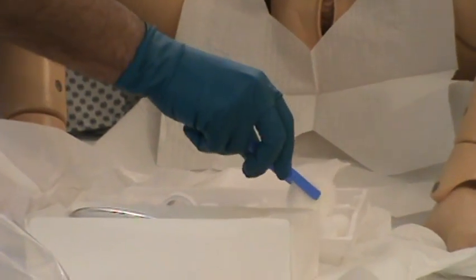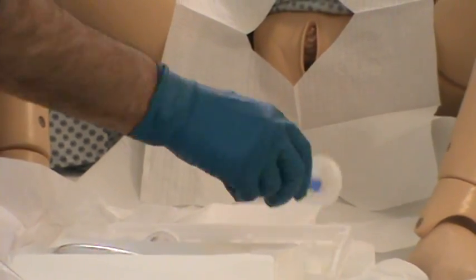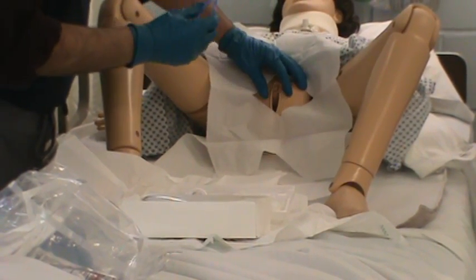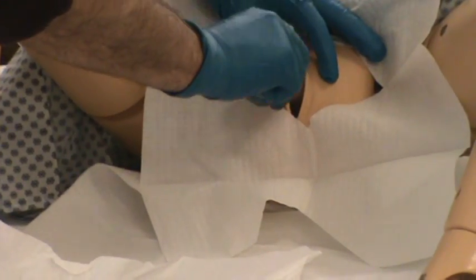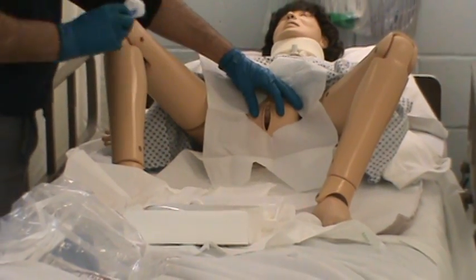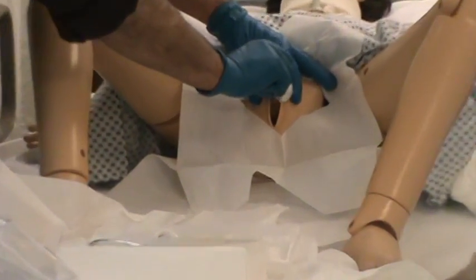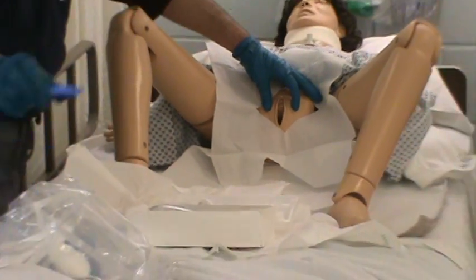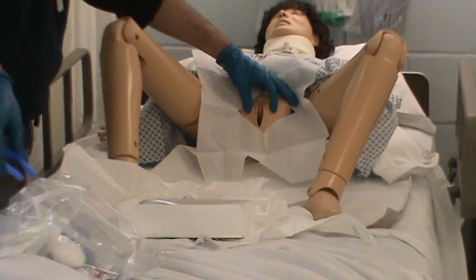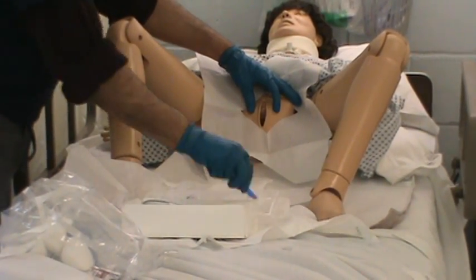I'm going to dab my iodine and dab my cotton balls around in the iodine. Now I'm going to spread the labia and wipe down one side. Notice how I'm not pulling this over my sterile field — I'm wiping and then coming around keeping out of my sterile field. Other side. With my last cotton ball right down the middle.